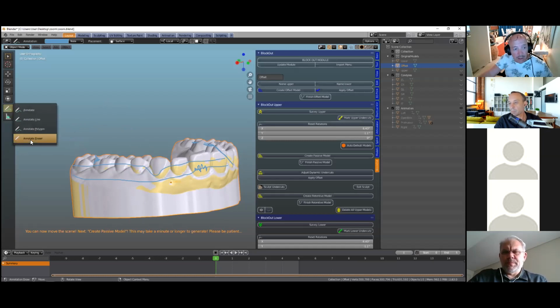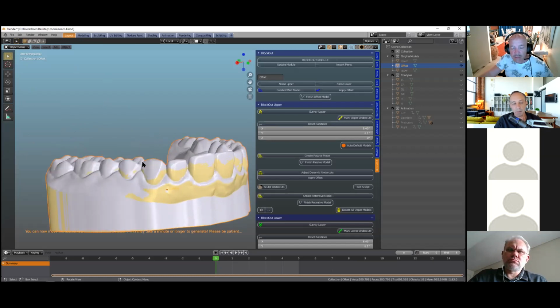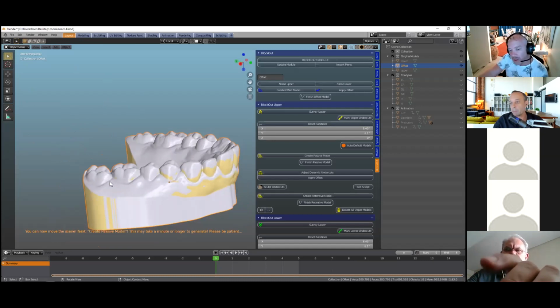Okay. So if there's any questions related to this, that would be quite good. So, Michael, can you talk about making a little divot between the teeth, like I said earlier? I would probably like a ball clasp. Yeah, I would do that right at the end, before we cut out the model. Yeah, okay.